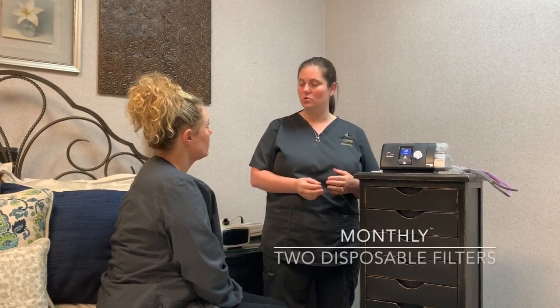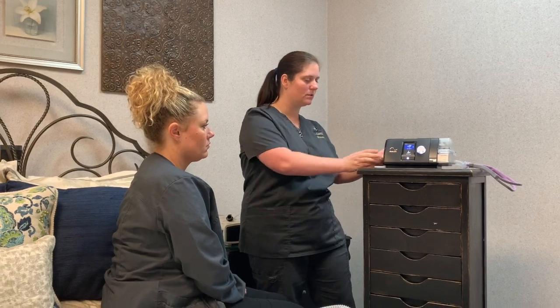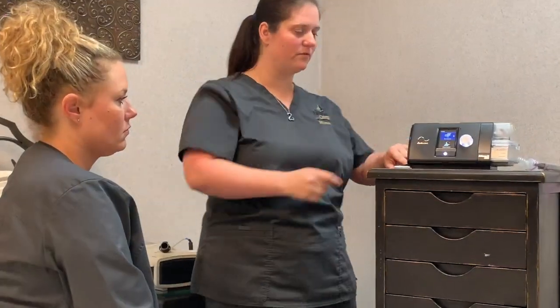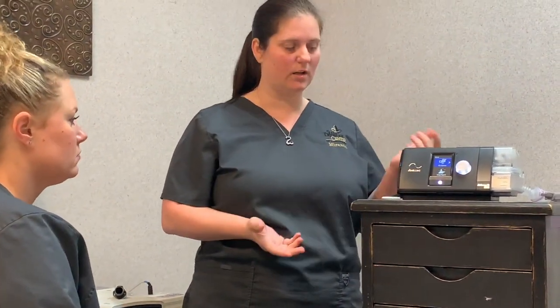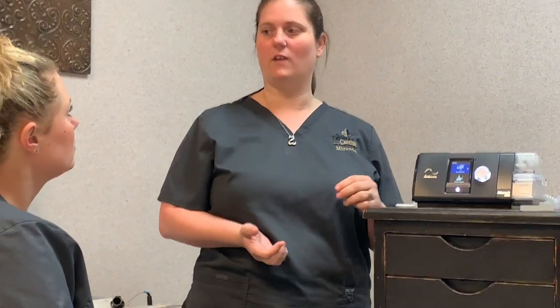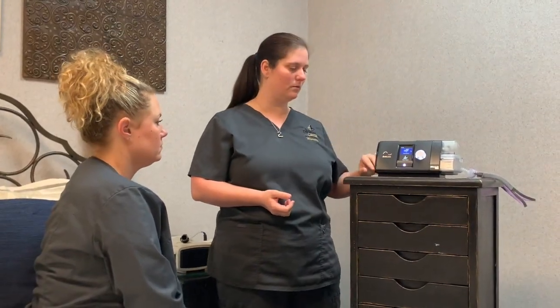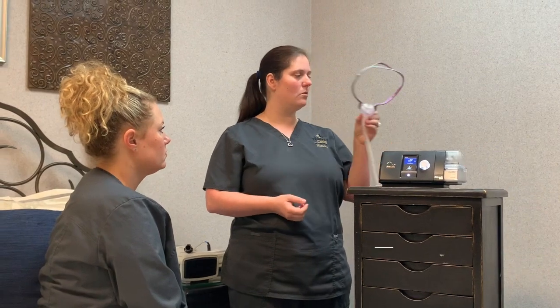First we'll go over the supplies. Monthly you're eligible for two disposable filters, which are right here. This little box just drops down and there's a filter right in there. You're going to change that every 30 days. Your machine is going to give you a little pop-up box on the front to let you know it's time to change that.